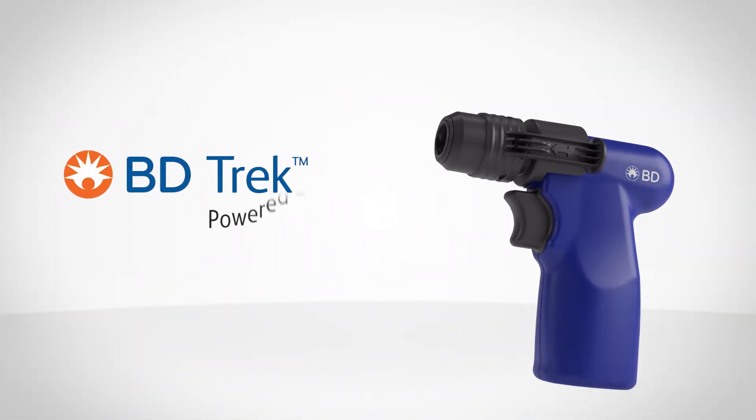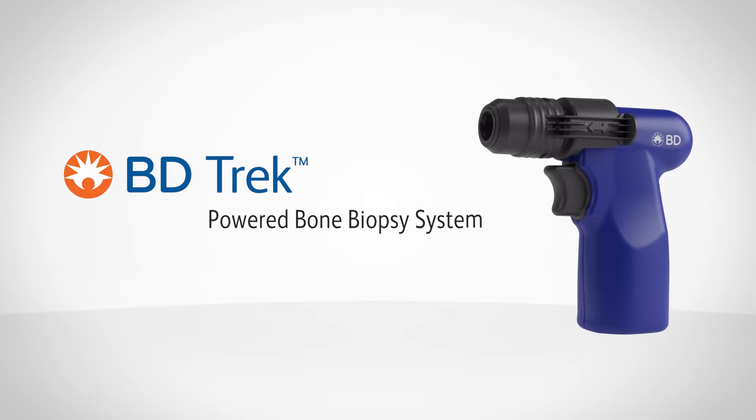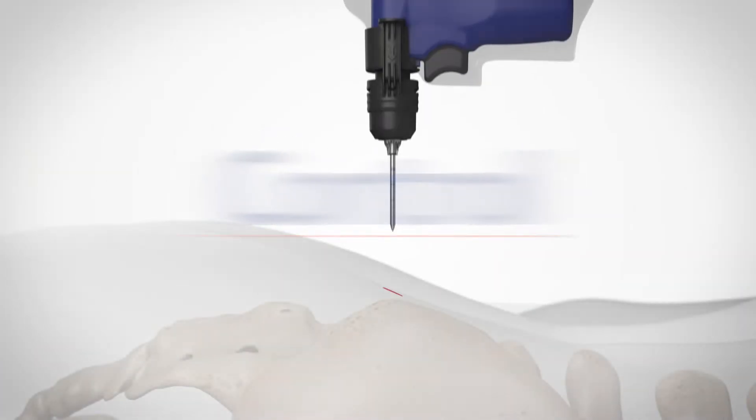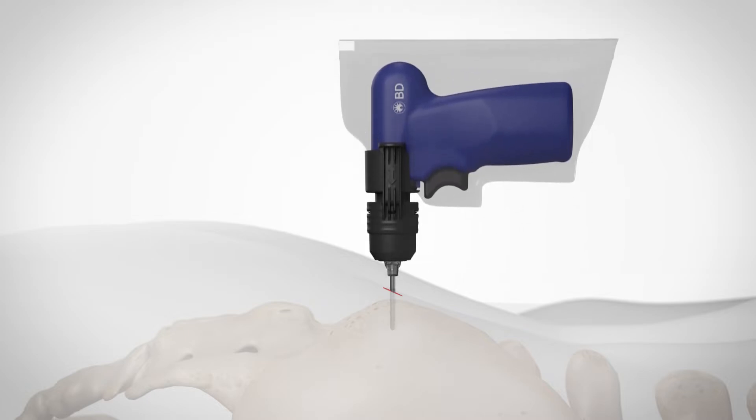How do we describe the BD TREK powered bone biopsy system? In a word: control. The control you need to perform bone lesion and bone marrow biopsies with precision, without compromising power.